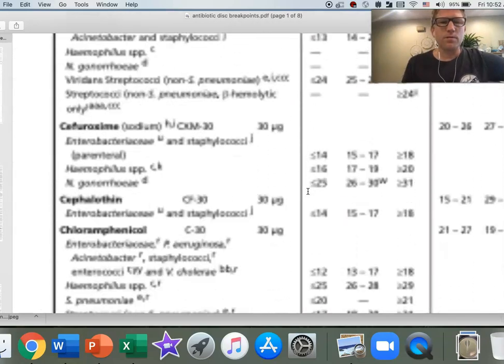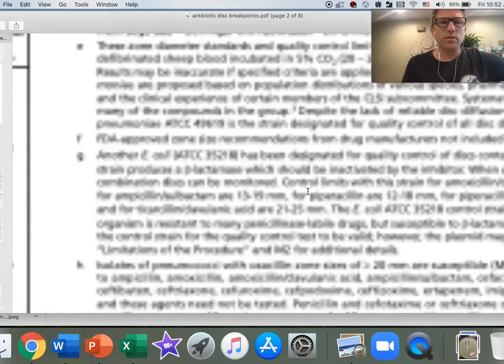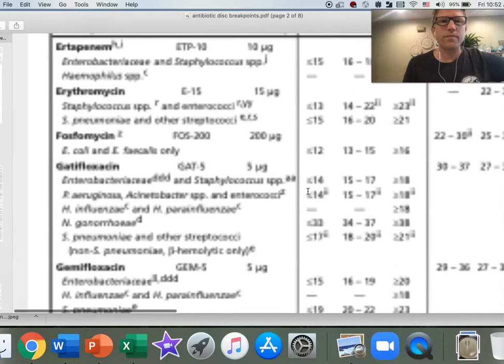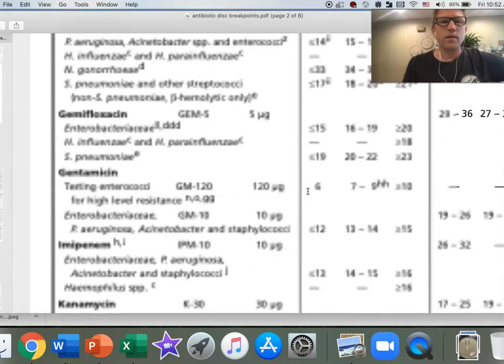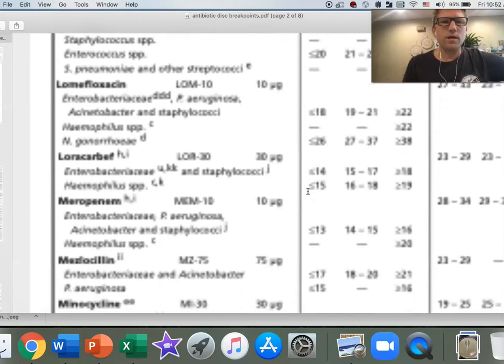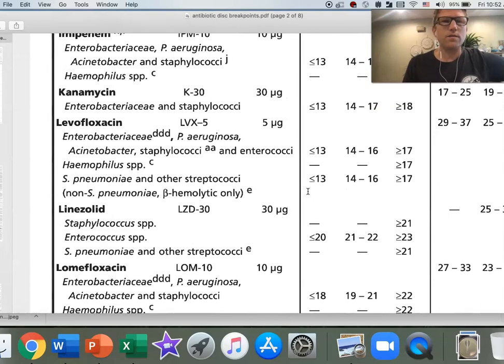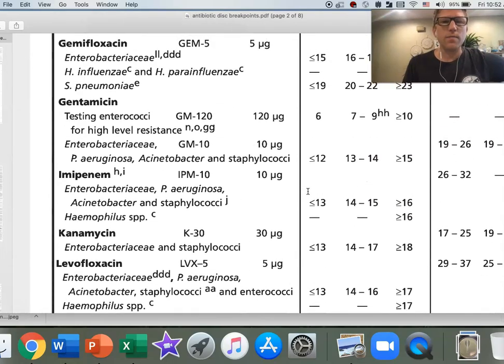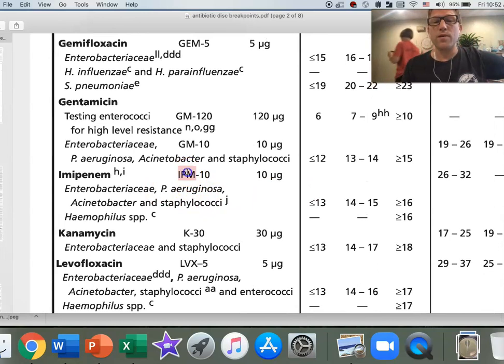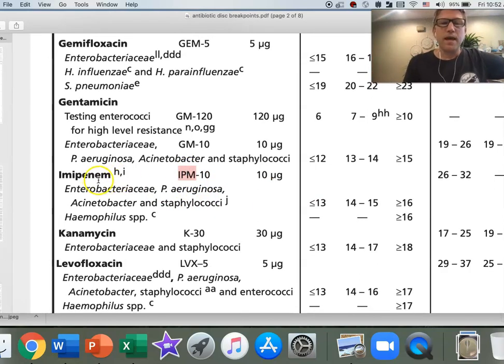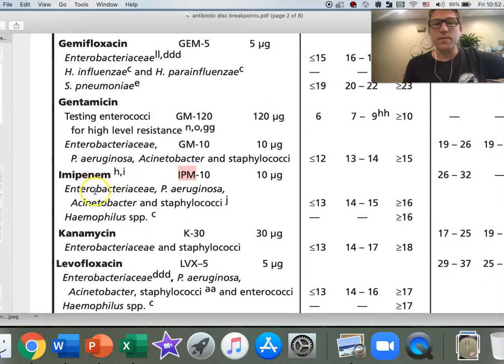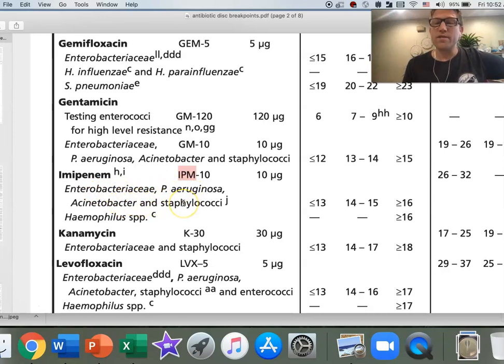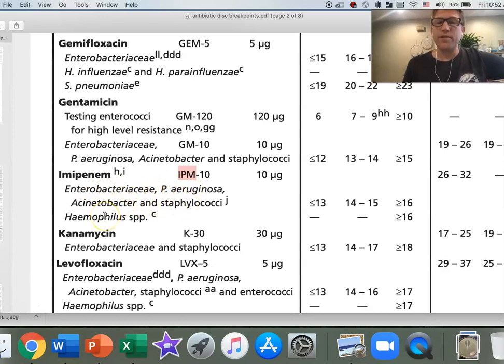In a typical clinical lab, you'd have standards for quality control. So we just need this section right here. Let's find imipenem. I'm just going to keep scrolling. Now I've got to move over. E-F-G-H-I-J-K, H-I-J-K, imipenem. If I didn't know that IPM was imipenem, I could just look for that abbreviation. You can see there's one set of breakpoints for the Enterobacteriaceae, Pseudomonas aeruginosa, Acinetobacter, or any of the staphylococci. And there's a separate one for Haemophilus.